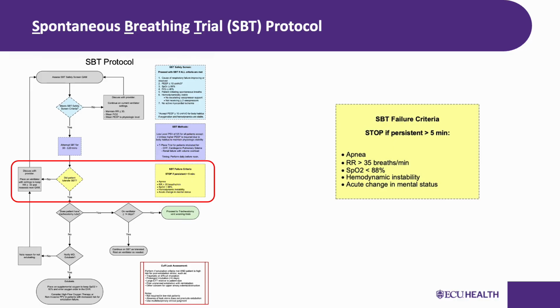First and most critical is apnea. If the patient becomes apneic during the trial, this is an immediate stop. We have backup rates, and here is an important safety point. All patients should have that backup rate on the mechanical ventilator during the SBT. Even during a pressure support trial, 5/5, make sure there's an apnea backup rate programmed. This protects the patient if they suddenly stop breathing.